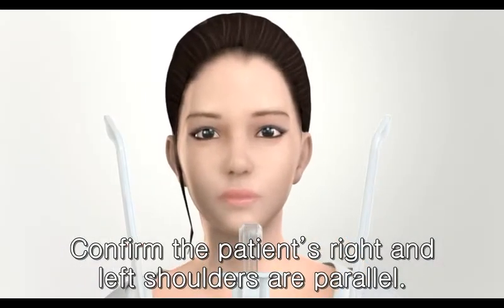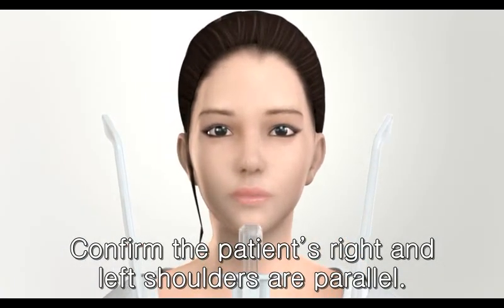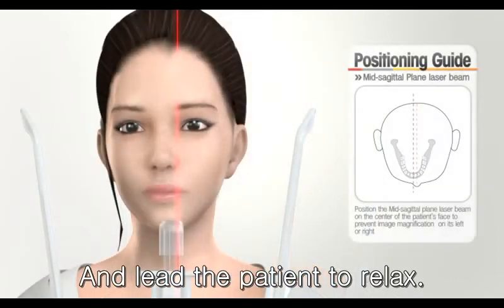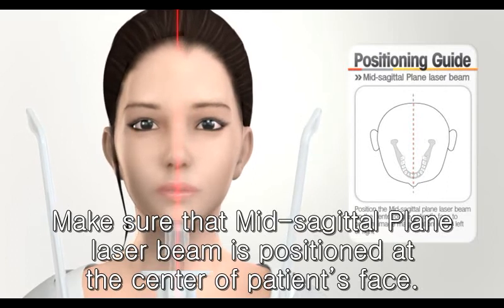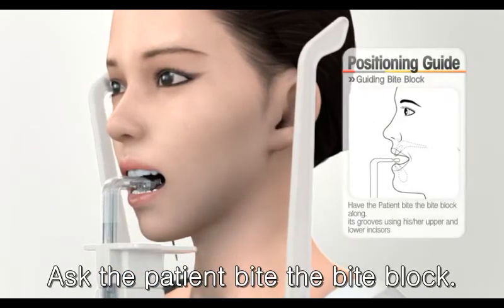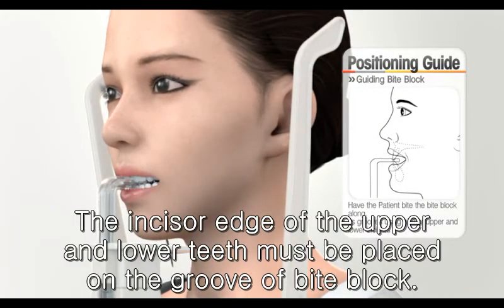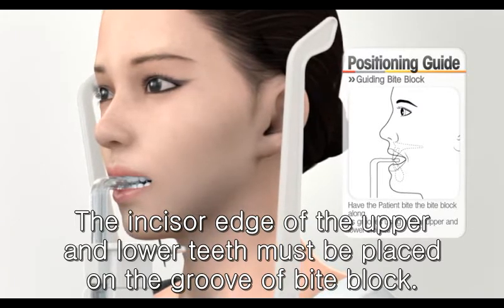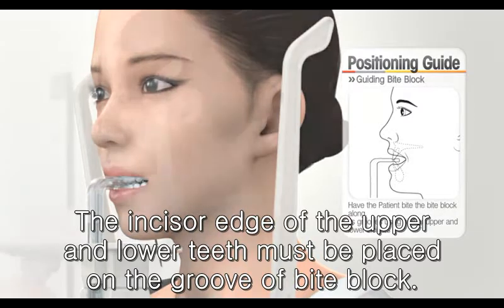Confirm the patient's right and left shoulders are parallel and lead the patient to relax. Make sure that the mid-sagittal plane laser beam is positioned at the center of patient's face. Ask the patient to bite the bite block. The incisor edge of the upper and lower teeth must be placed on the groove of bite block.